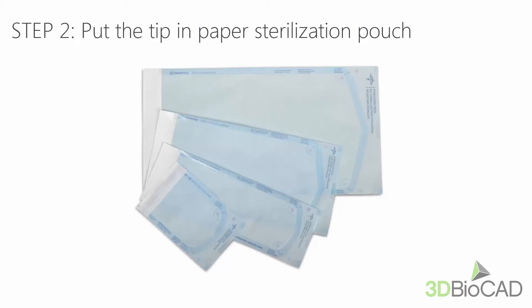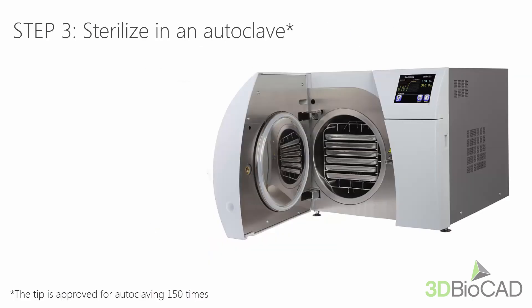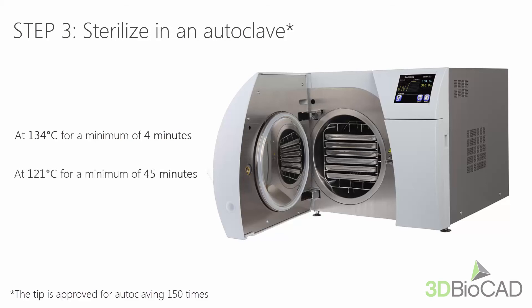Now put the tip in a paper sterilization pouch, which should be sealed airtight. Use either a self-adhesive pouch or a heat-sealed one. Proceed with the sterilization in an autoclave with one of the two programs: 134 degrees Celsius for a minimum of 4 minutes, or 121 degrees Celsius for a minimum of 45 minutes. Use an autoclave program that dries the wrapped tip before opening the autoclave.